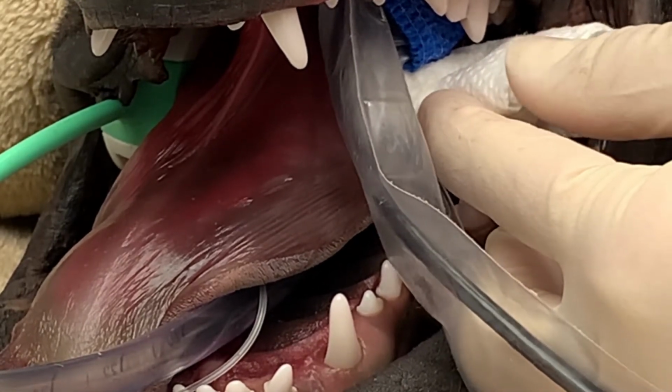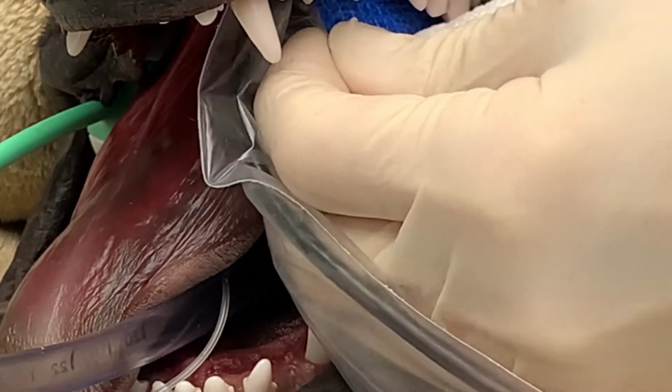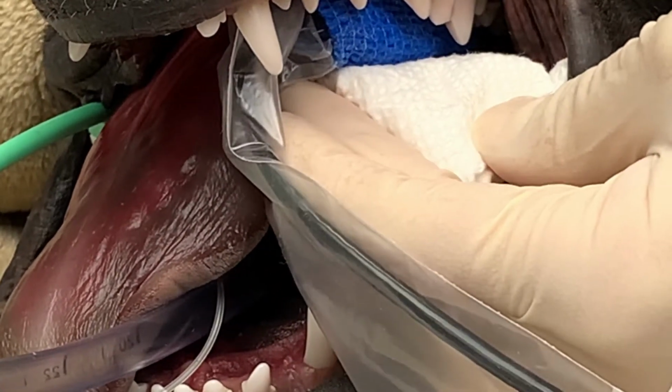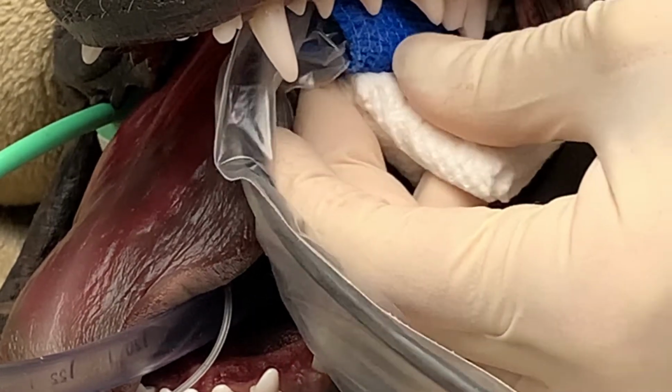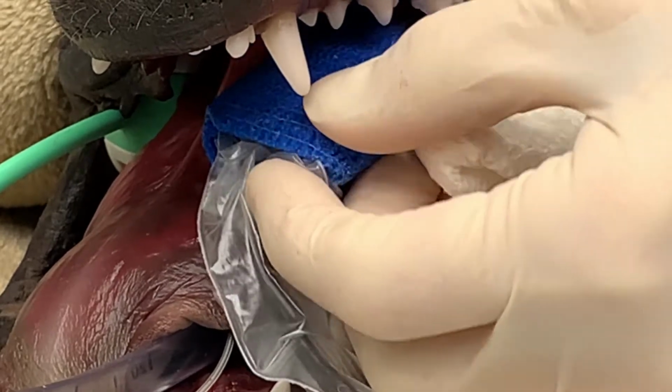And then we'll just continue to move this sensor forward, and we will also need the use of those gauze squares or paper towels to help us keep that sensor touching the crowns of the teeth and parallel to the palate.